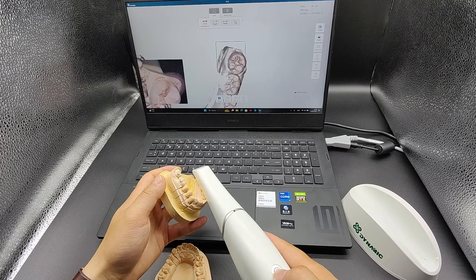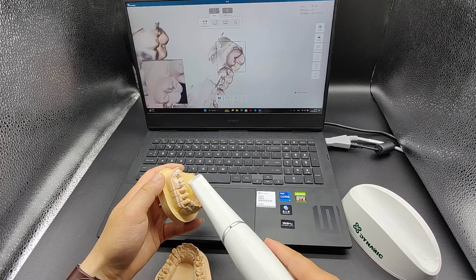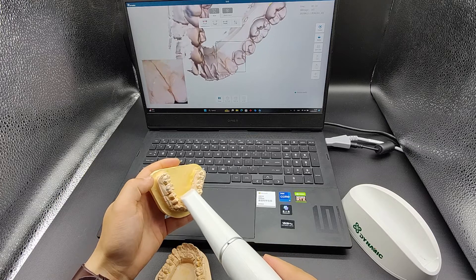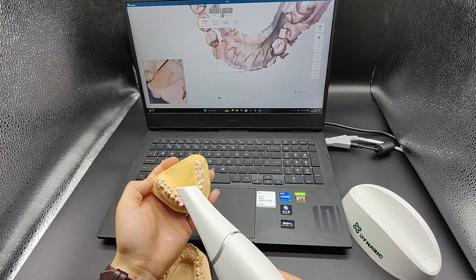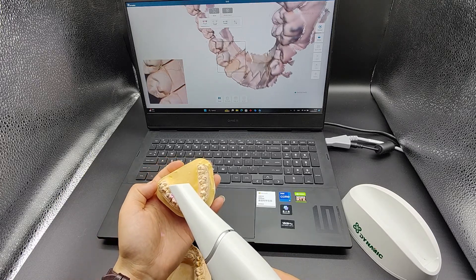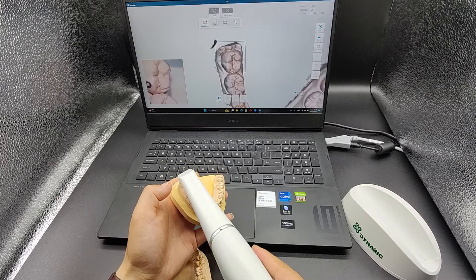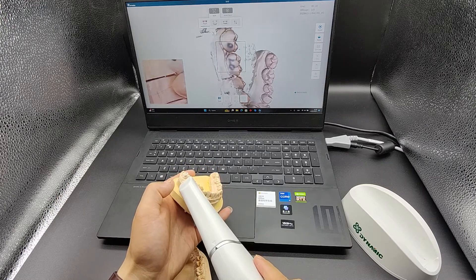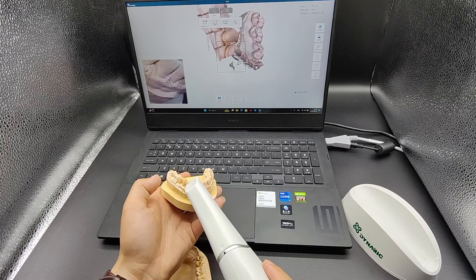After completing the occlusion surface, rotate the scanner and scan the lingual surface. After completing the lingual surface, rotate the scanner and scan the buccal surface.